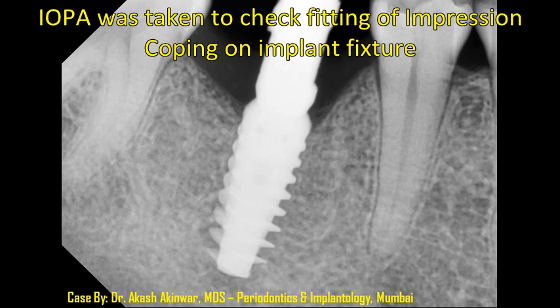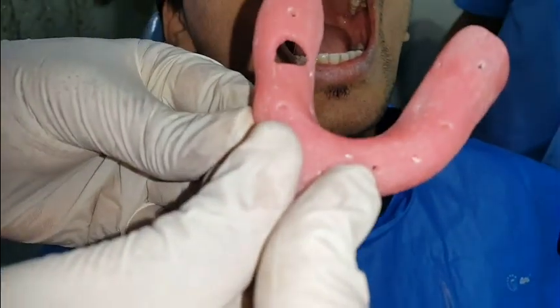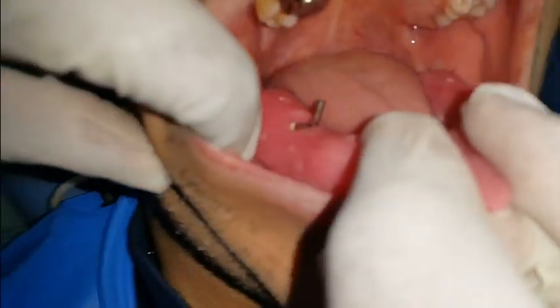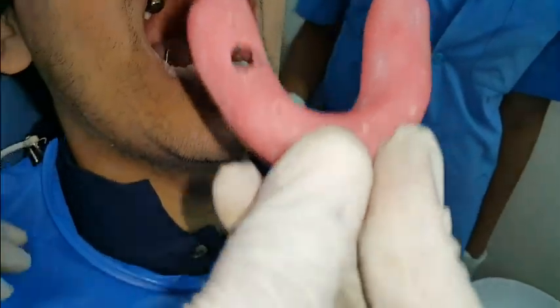Now before starting with the open tray impression procedure I am going to check this customized tray in the patient's mouth. This is just perfect.